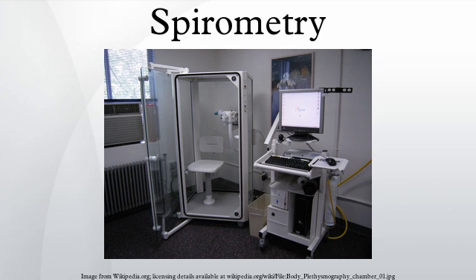Atmospheric pressure and/or altitude will also affect measured DLCO, and so a correction factor is needed to adjust for standard pressure. Online calculators are available to correct for hemoglobin levels and altitude and/or pressure where the measurement was taken.